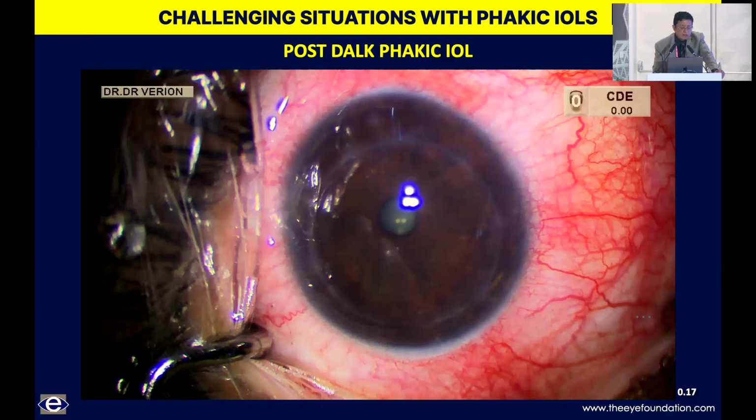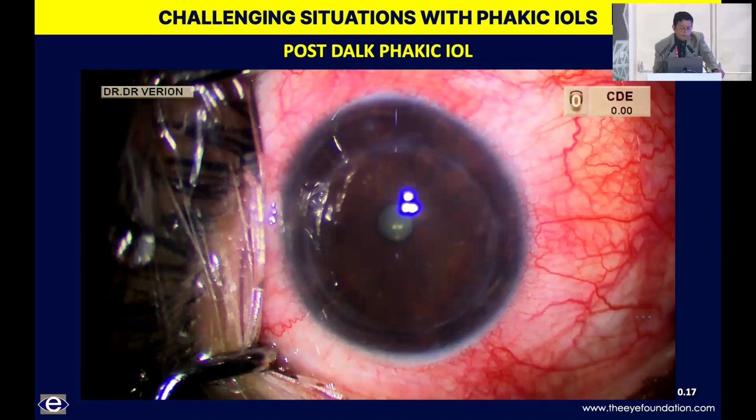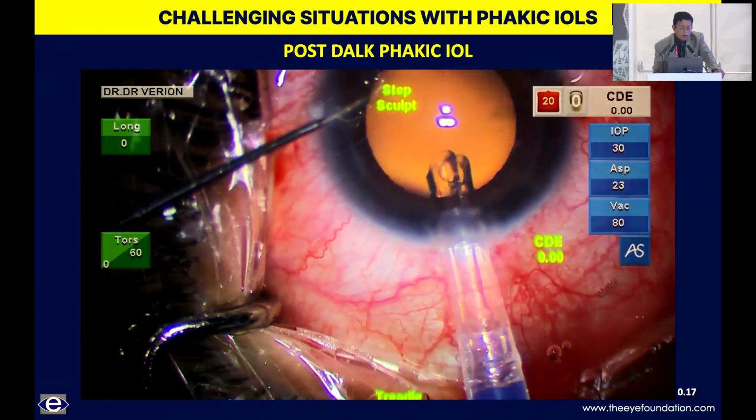And just in case this is a post-DALK phakic intraocular lens, sometimes post-PK, post-DALK, you have a high astigmatism, even though the cornea is quite clear.